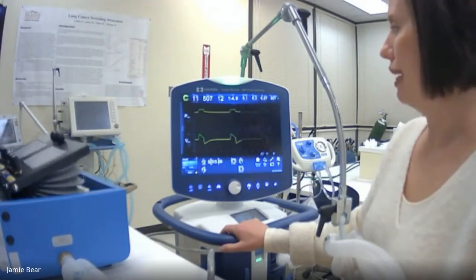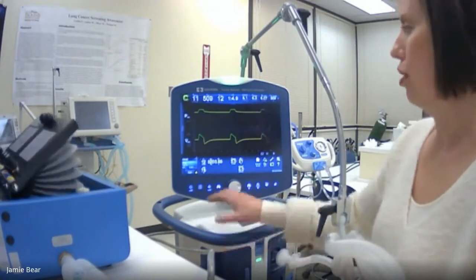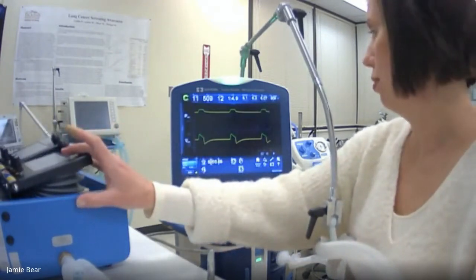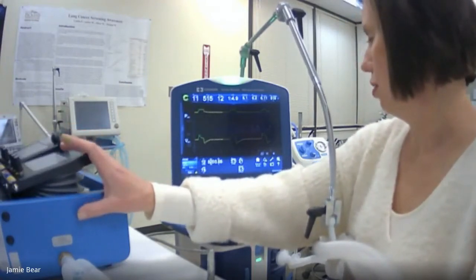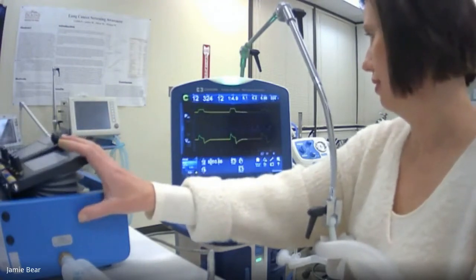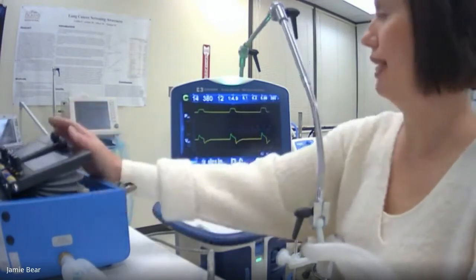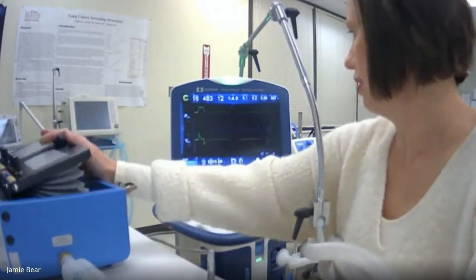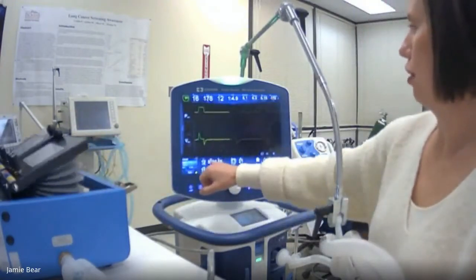So now, as the pulmonary mechanics change, you can see a varying flow. Okay, good. See that difference in flow there? Okay, the patient got a little bit tighter. So now, based on that, our peak pressure can go up, and it is. It's going to rise up a little bit. We're still going to try and get to that consistent tidal volume.